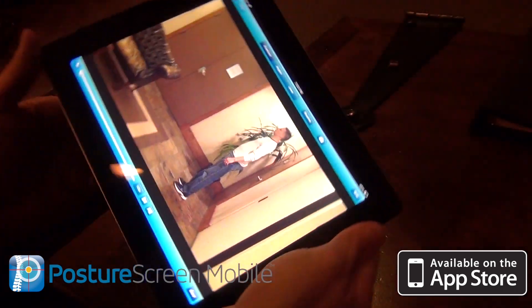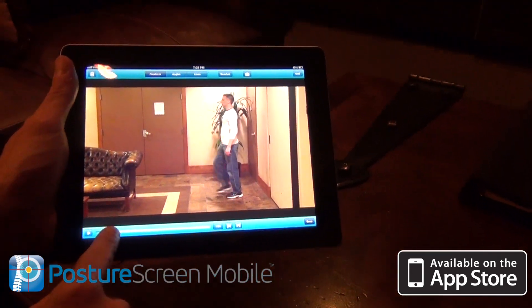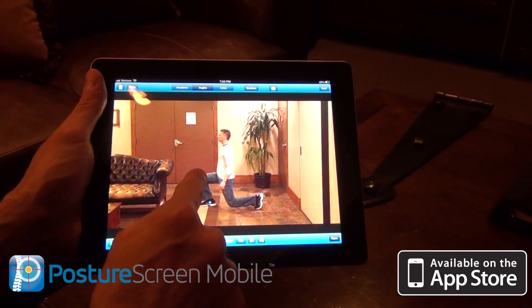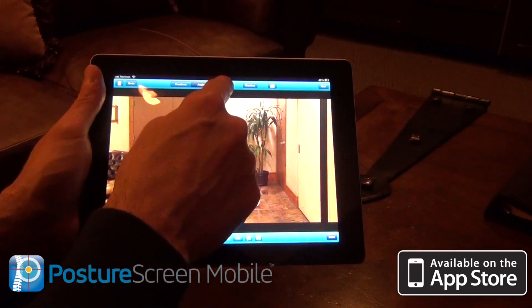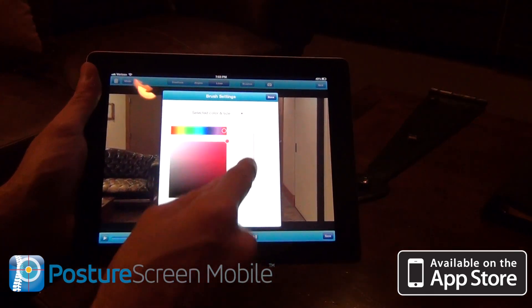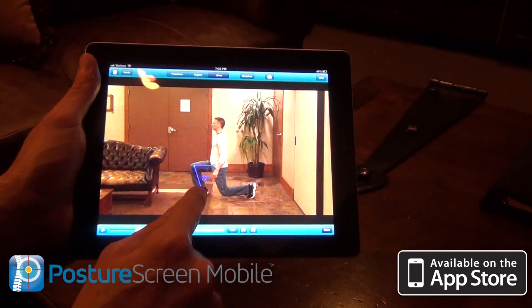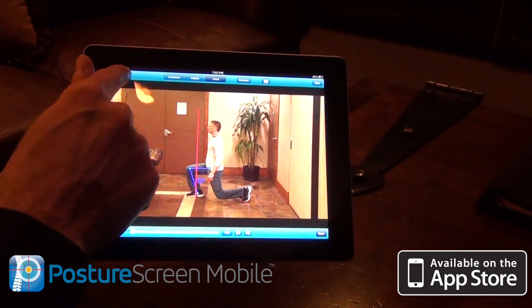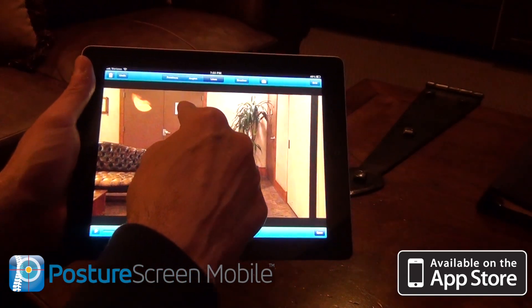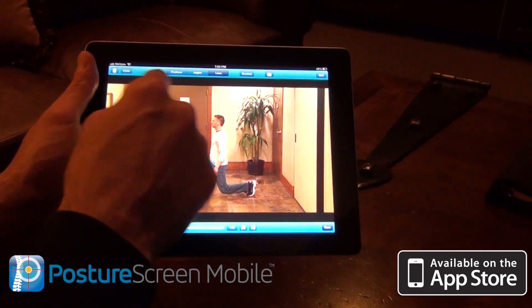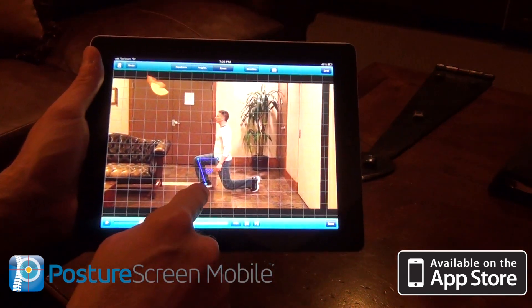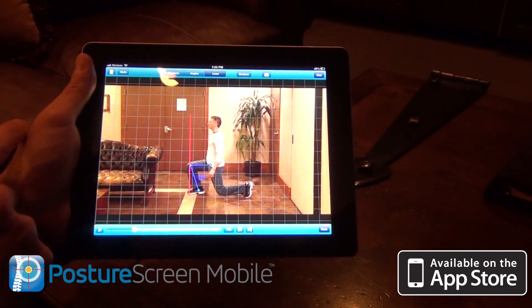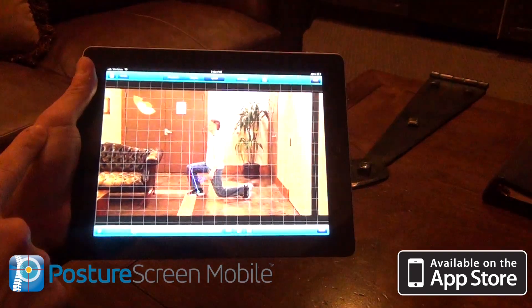Now we're going to do his lunge. Let's go ahead and scrub through - and as you can see, we have a problem already. Let's go ahead and do the angle here. I'll change the color and draw a vertical line up here. You can see his knee is coming out too far. We can do a vertical axis line from the toe, or put the grid over this, and put a line up from the toe. You can see his knee is coming a little too far forward. Let's snap a picture of that.